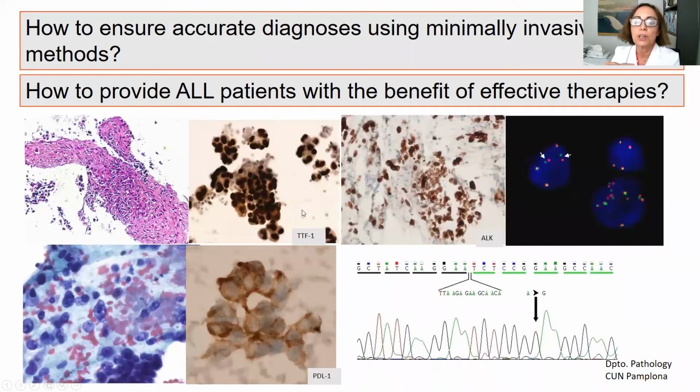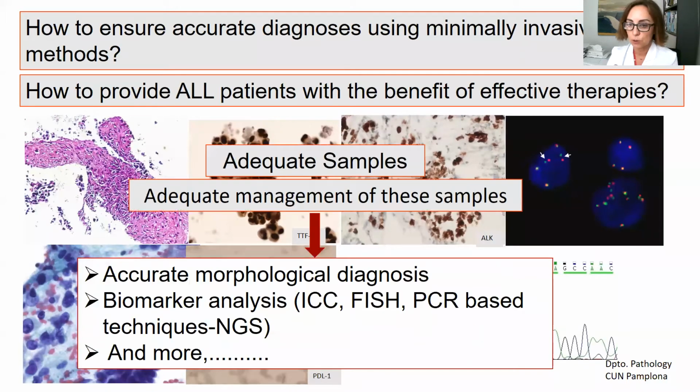The important question, I think there are two important questions. First one, how to ensure accurate diagnosis using minimally invasive methods? And the second one, and most important, I think, is how to provide all patients, not some of them, all patients with the benefit of effective therapies. And the answer is with adequate samples and with an adequate management of the samples.